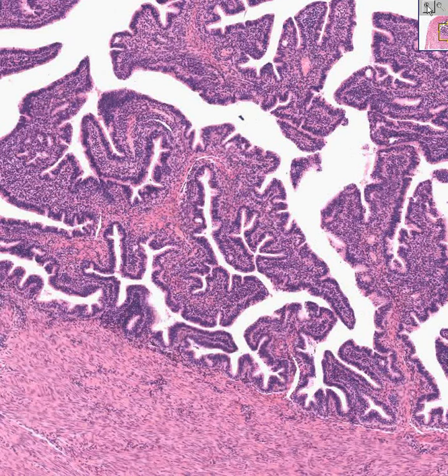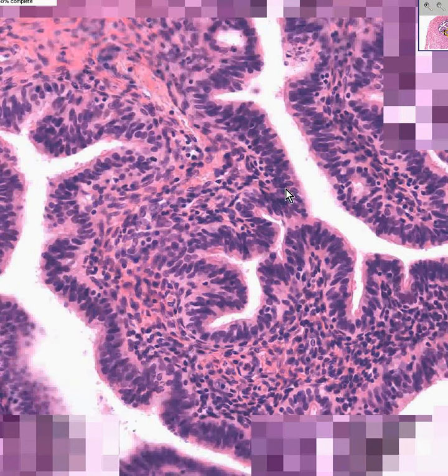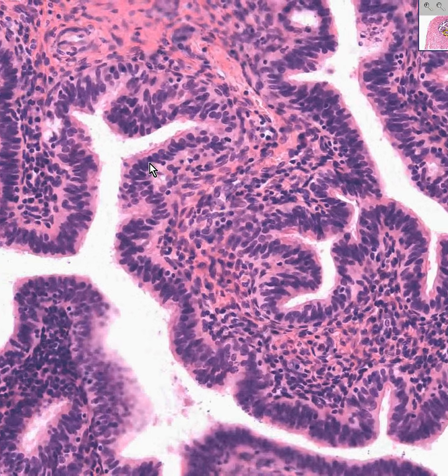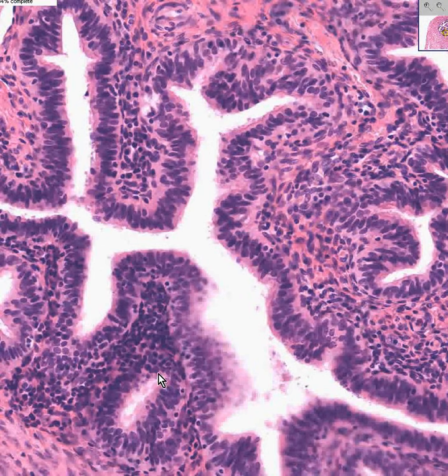Like the rest of the Mullerian duct structures, it is a columnar epithelium. It is supported by probably fibroblasts here and a little bit of smooth muscle as well. It is non-stratified. And even though we mentioned that the fallopian tube has 4 different areas, the epithelium of the mucosa looks a lot like this. And do you see some cilia here? Could that be perhaps because it wants to transport things like sperm, perhaps?